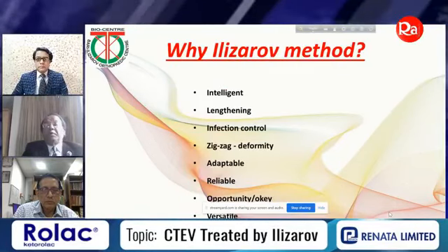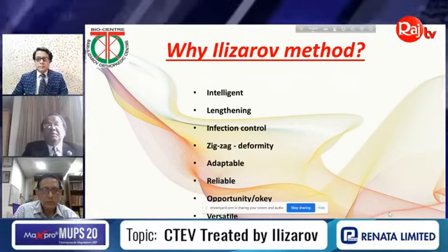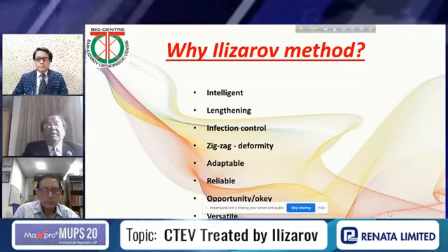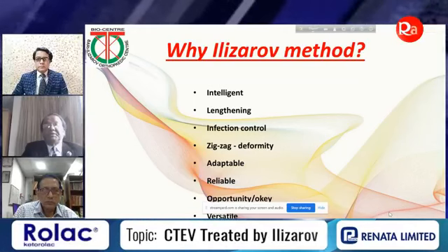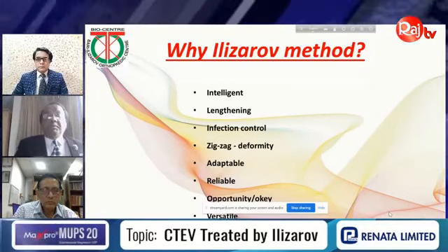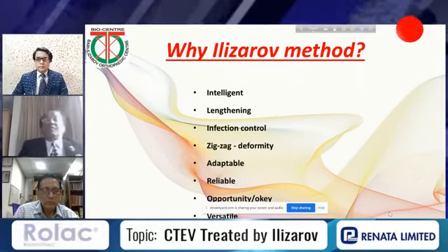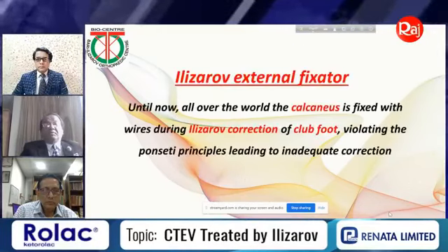Why Ilizarov? I always tell this. Intelligent, first alphabet you see, you can go for lengthening. I, you can control the infection. Zigzag, you can correct the deformity. This is reliable, adaptable, reliable. You have got a lot of opportunity, and of course, the versatile, you are getting the victory.